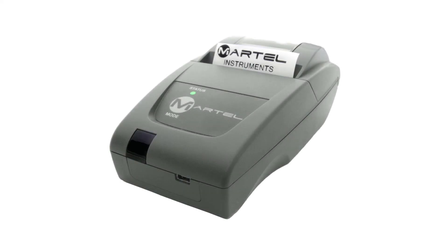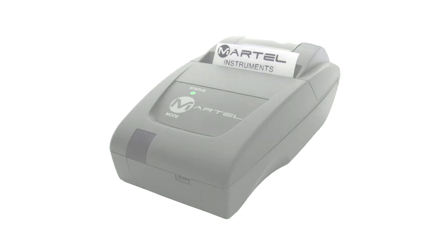If the device is connected to a printer, when the result shows on the screen you can press the off button and the result will be printed and the device will turn off.